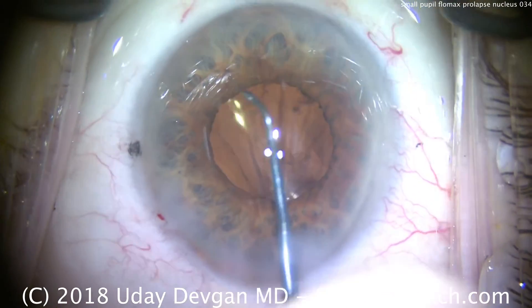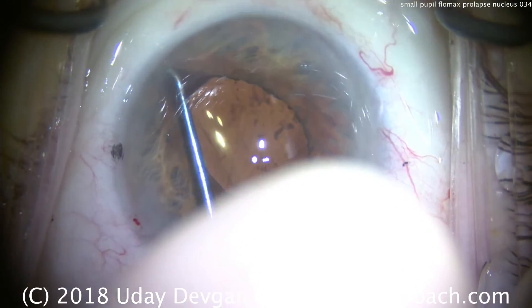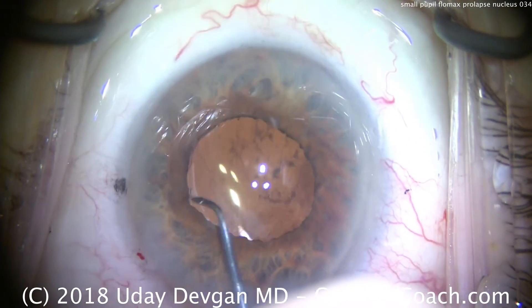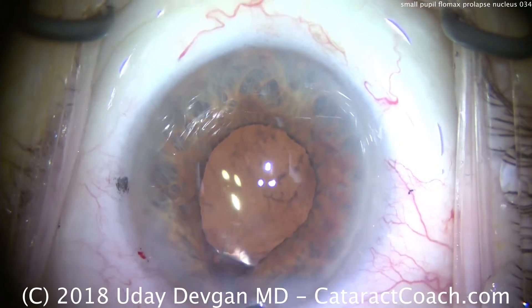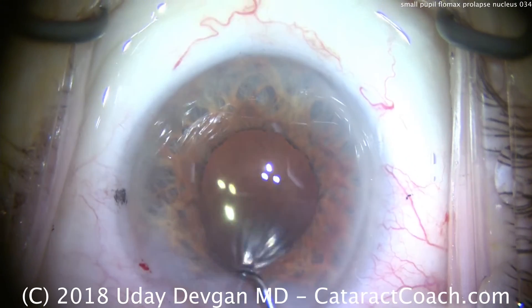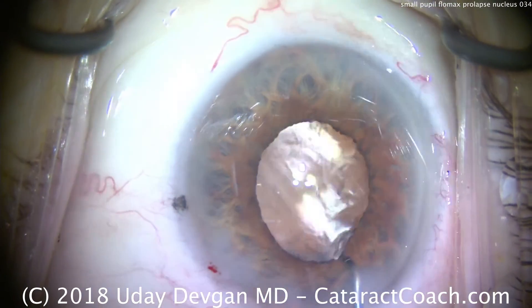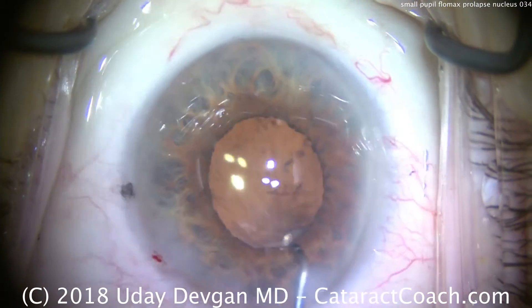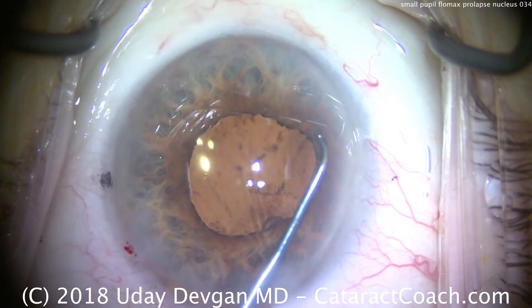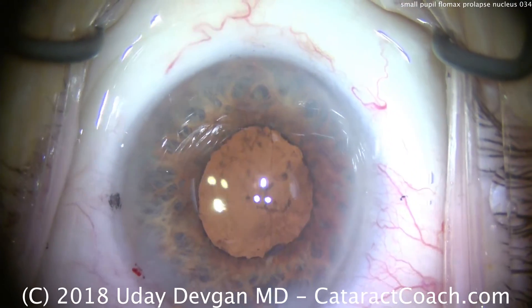Since it is a toric lens, let's place the lens a little bit shy of the final position. Now, importantly, let's check 360 degrees. Use the chopper to lift the iris with the eye still full of viscoelastic. Oh — there's some material there. There's a little bit of cortex material sub-incisionally. We'll have to get that out — that can't stay. The rest, you can see, is under the rexis edge. There's the rexis, by the way — looks like a beautiful rexis.